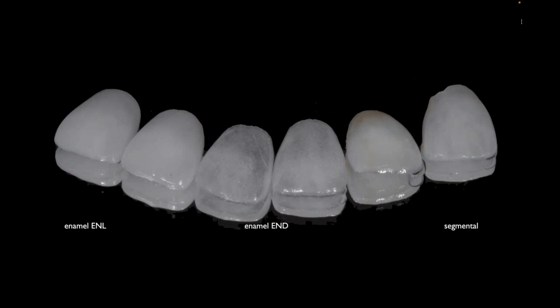And what I want you to notice here is exactly what I said happens. When I used the whiter, brighter type enamel, notice that even by the cervical of those 2 veneers all the way to your left, they still have that whitish effect to them. Yes, they'll get some color from underneath and they do have translucency, but you do realize that they're going to make a tooth appear brighter or whiter, and you're not going to see as much of the tooth that's behind it after this is bonded on.